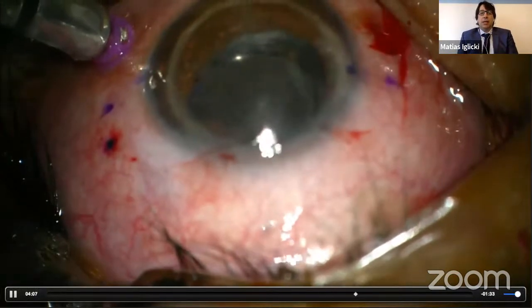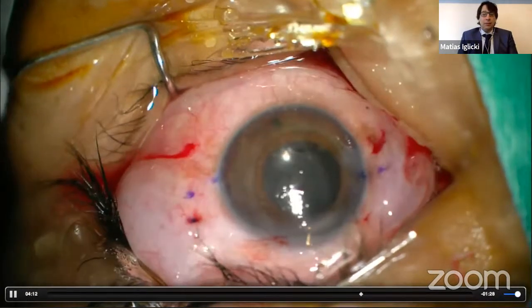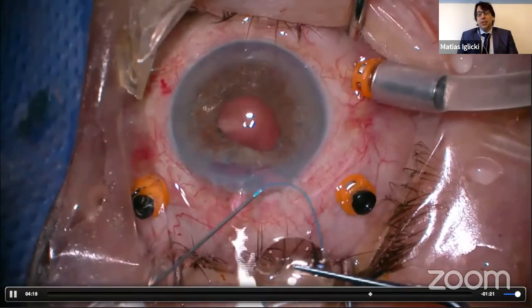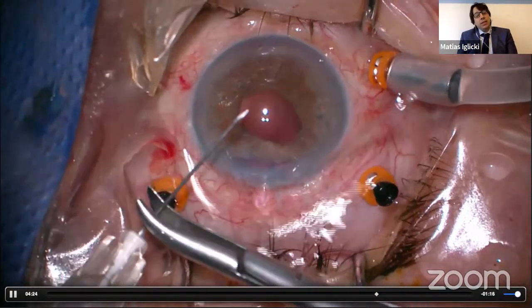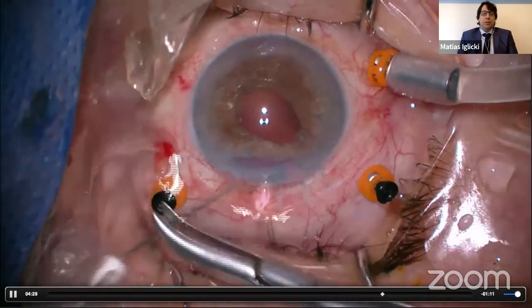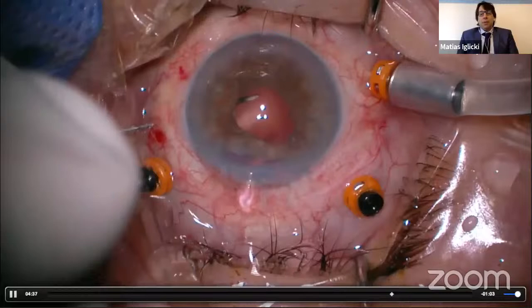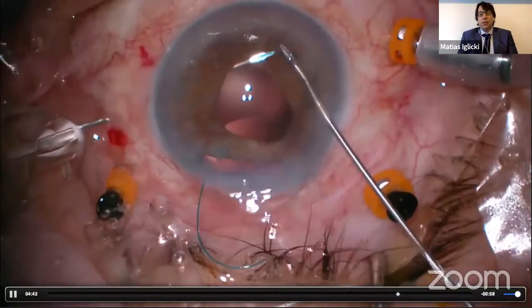So as you can see at the end, in this complicated case, the intraocular lens is very well centered. You see a little bit of decentration, but it's because of the iris, not because of the lens. As a recommendation for this technique, check first if the haptic goes inside the needle, because when you are inside the eye, it's a little bit difficult to do it, and it's a step that we want to avoid. Just in case: it doesn't happen with this needle that is pre-tested, but it happened with the 27 gauge needle.